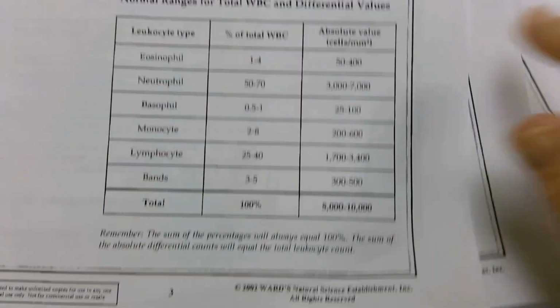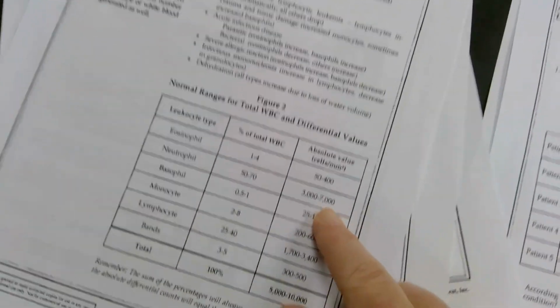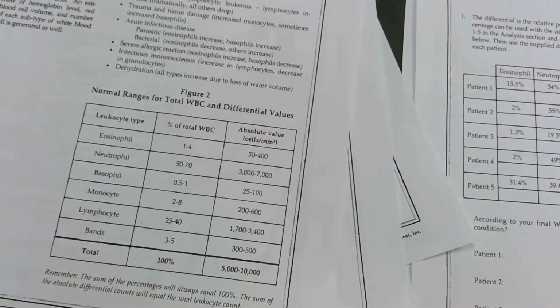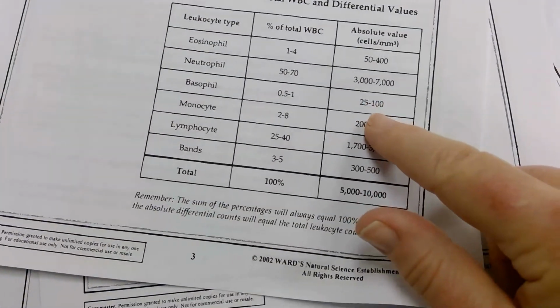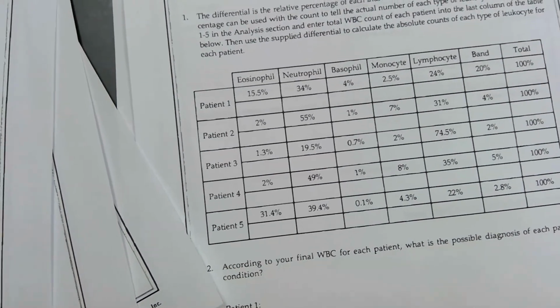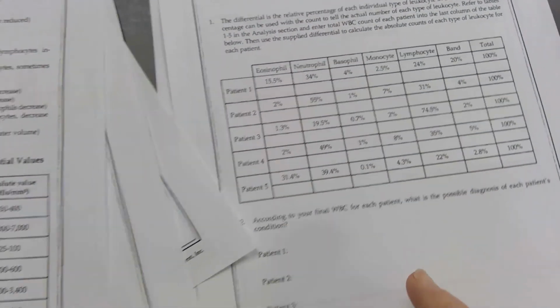So then we would look at their neutrophils and compare that and see if it's within the normal range. And an easy way to do this is to get a highlighter and go through, compare each patient's cells. If it's abnormal, highlight it. If it's normal, just leave it alone. Then you can see which counts are abnormal.